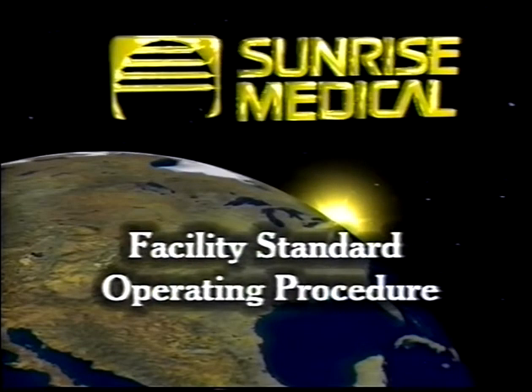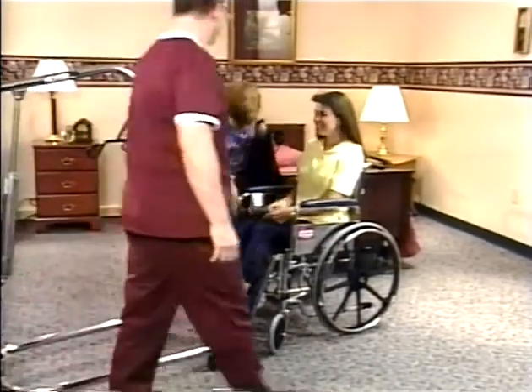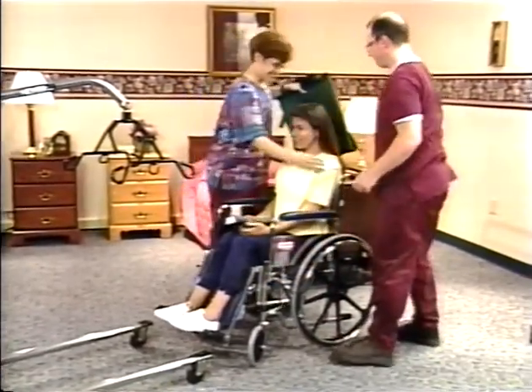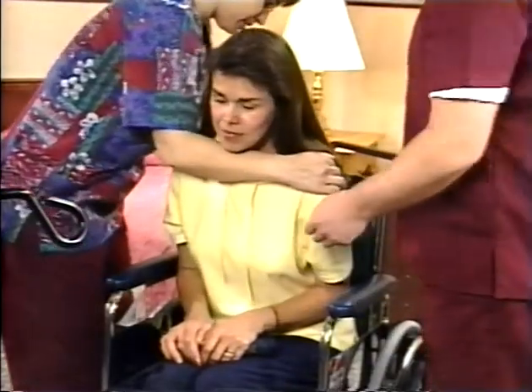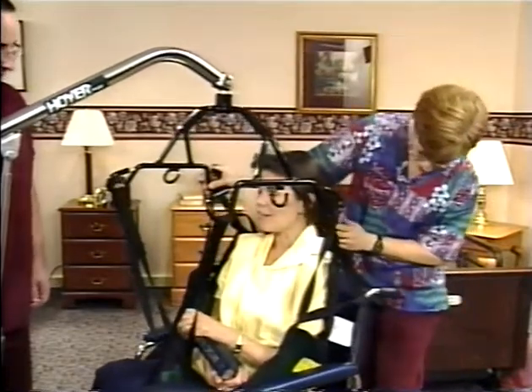Always refer to your facility's standard operating procedures for resident transfer using mechanical lifting devices. It is important that both caregivers performing the lift understand the proper techniques and communicate well during the procedure. One member of the team should be team leader and direct the other. You need to be comfortable in either role.